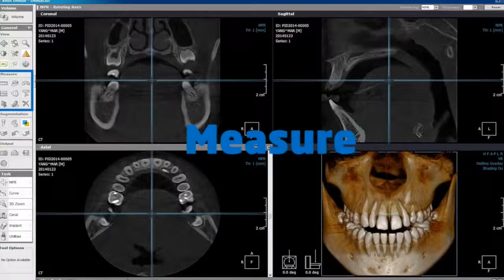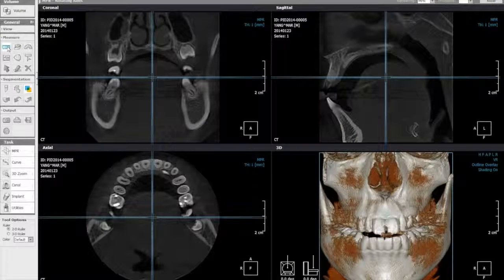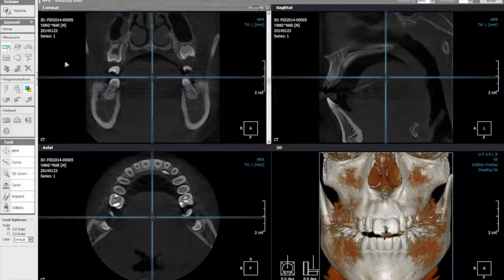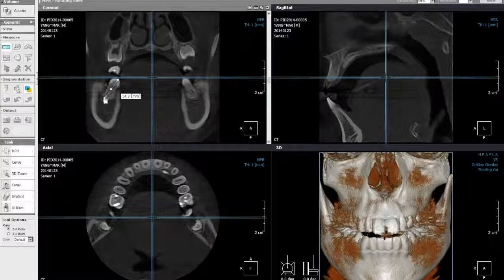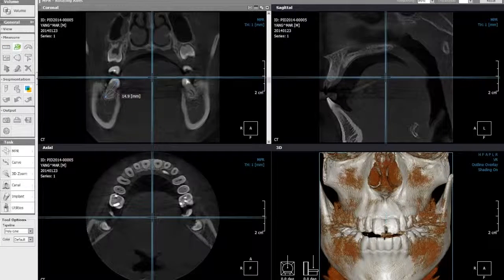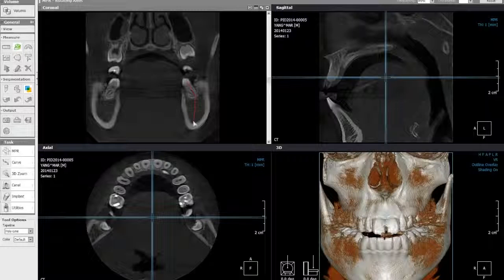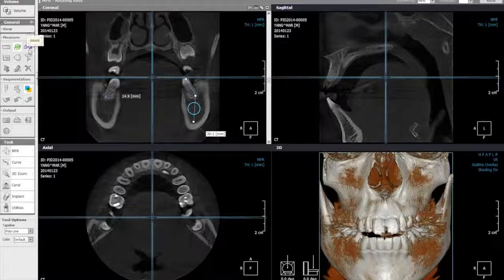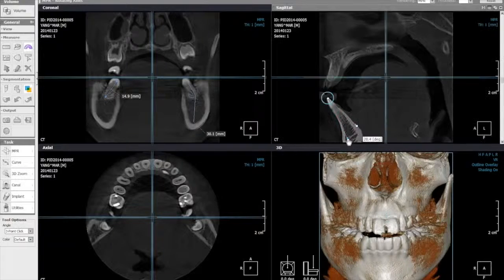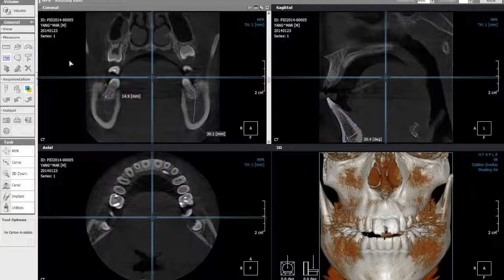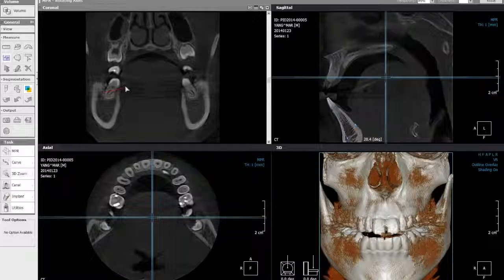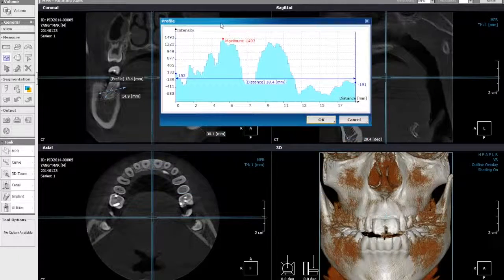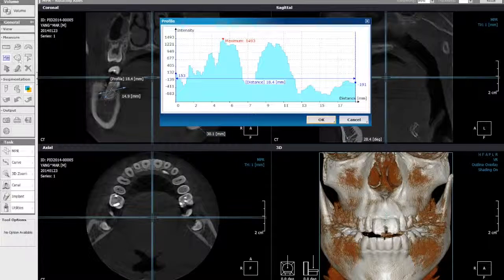The next section is measure tools. You have a standard single line measurement — a single left click will start and stop. You can also do a multi-line or tape line, allowing multiple measurements with a total of the line. You can do angles. There is also a profile tool which lets you draw a line throughout the image and gives you a graph of density changes along that line, so you can see the greyscale values for those particular areas.